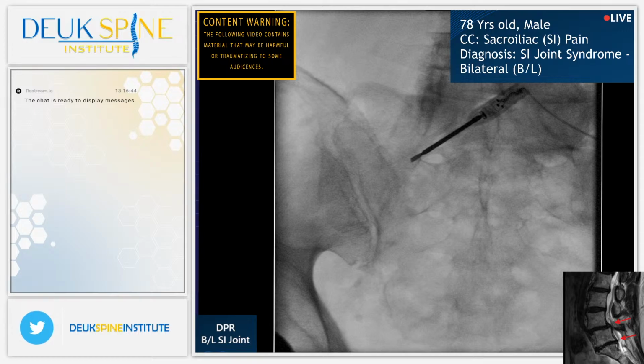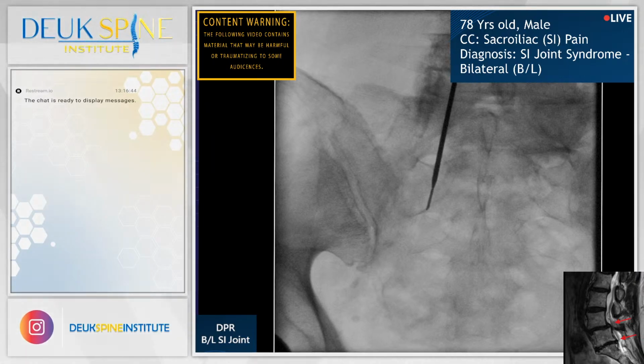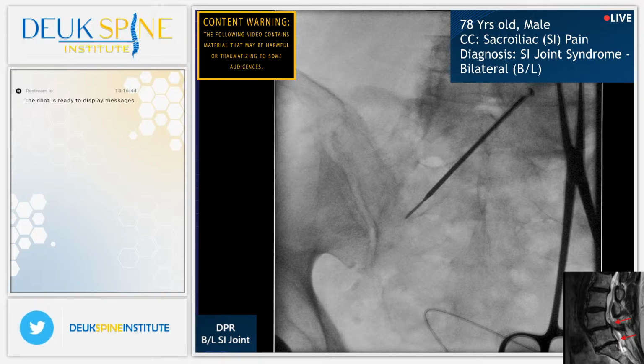Shot. Shot. I'm not giving up. Shot. That's perfect right there.